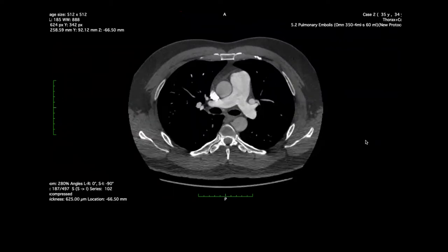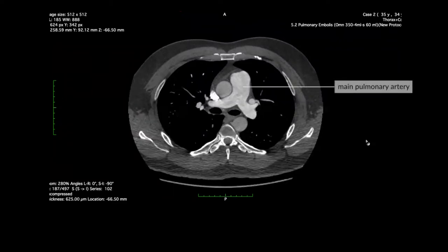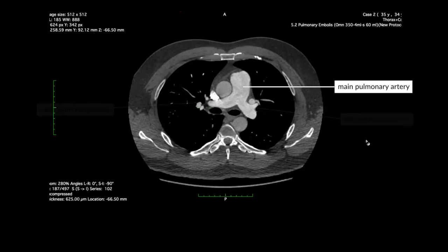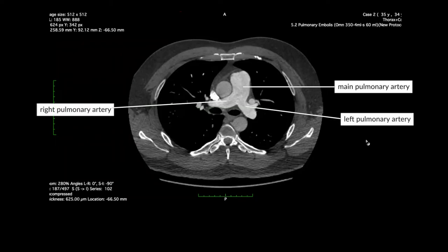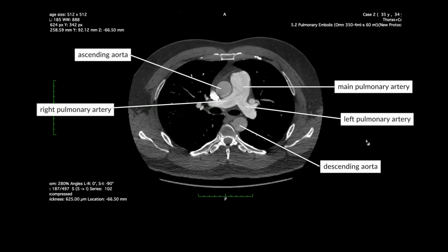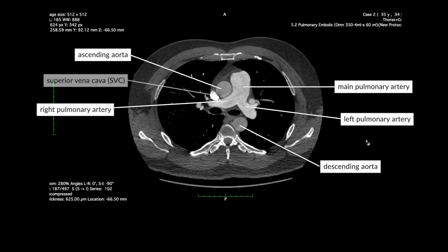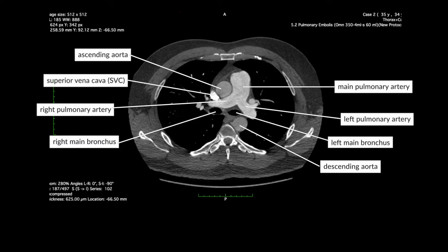To recap the anatomy, this is the level of the main pulmonary artery. Here we have the main pulmonary artery, the right and the left pulmonary arteries, the ascending and the descending aorta, the SVC, the right and the left main bronchus, and the esophagus.